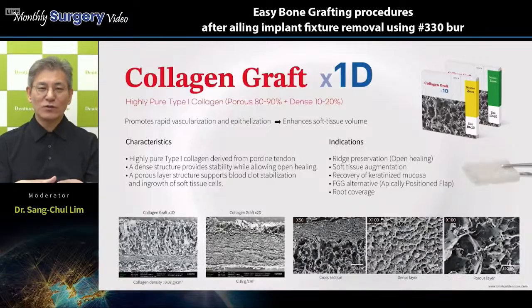Sometimes we get a wound open situation after GBR procedures or other complex procedures, and this collagen graft compensates for this open wound situation. Compared to the barrier membrane, this collagen graft is better for faster epithelialization and faster soft tissue healing.